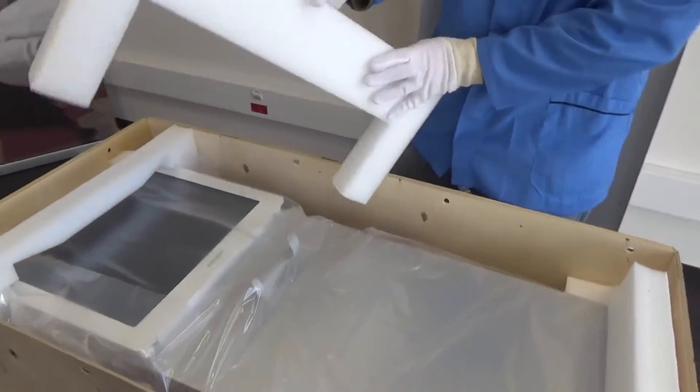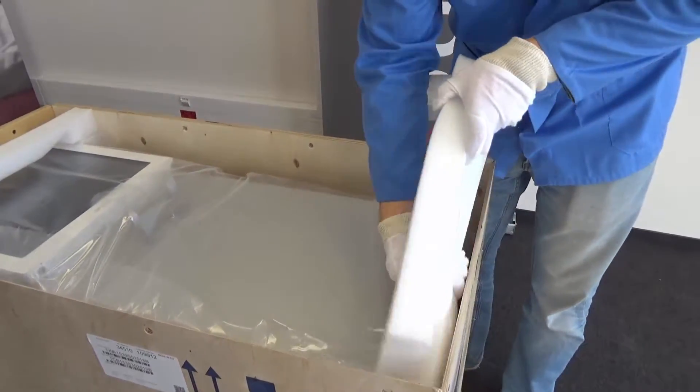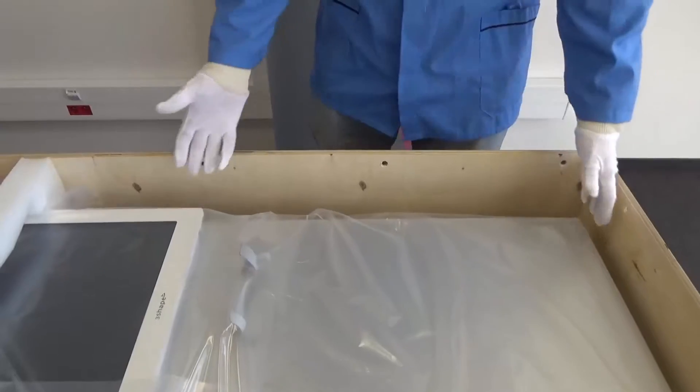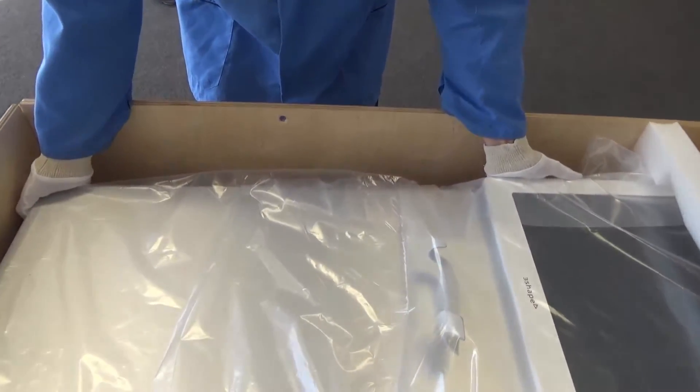Remove the two foam layers, except the one placed on the top of the cart. You will need four hands to lift the Trios cart out of the box. Grab the lower part around the side of the screen. Do not touch the display.